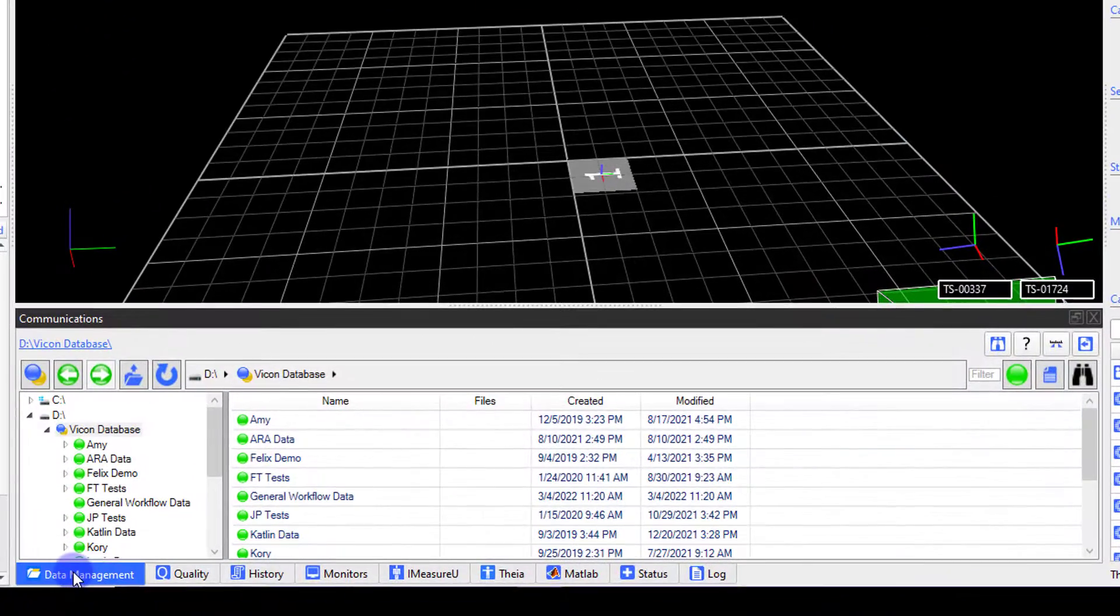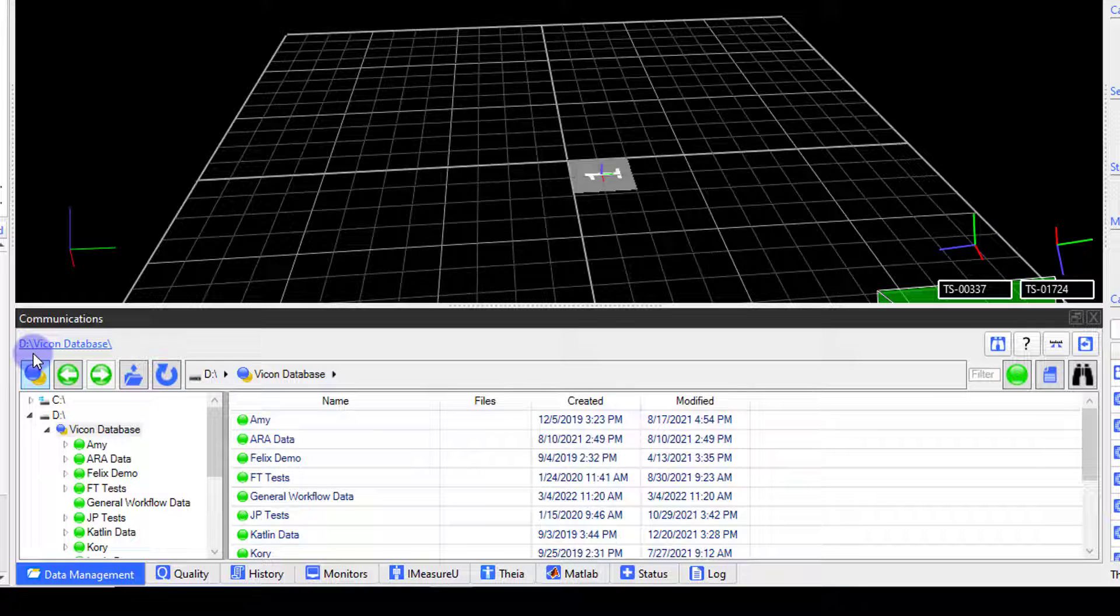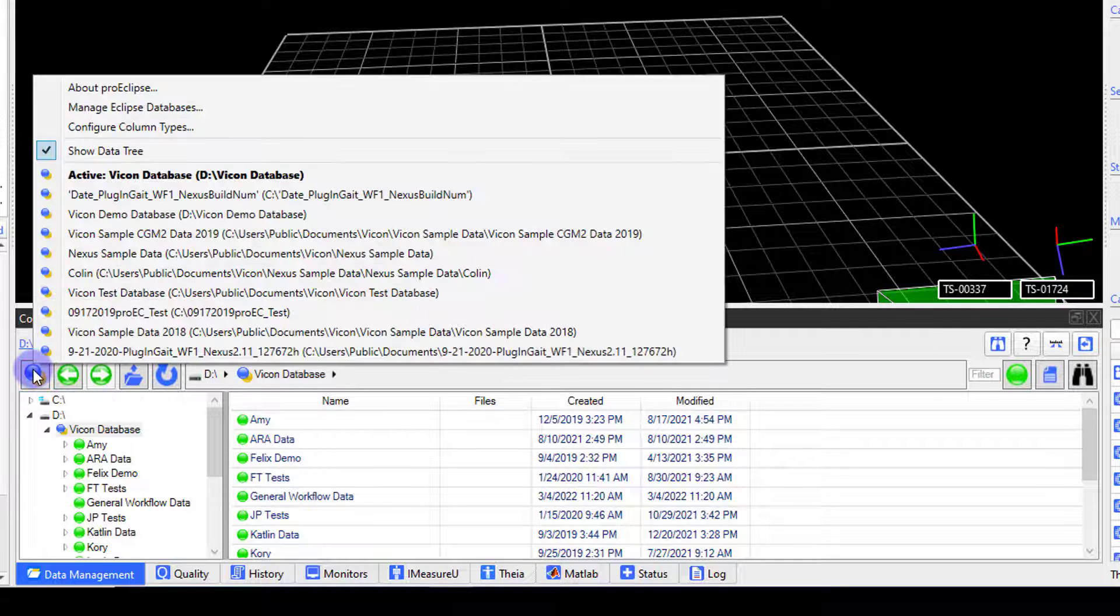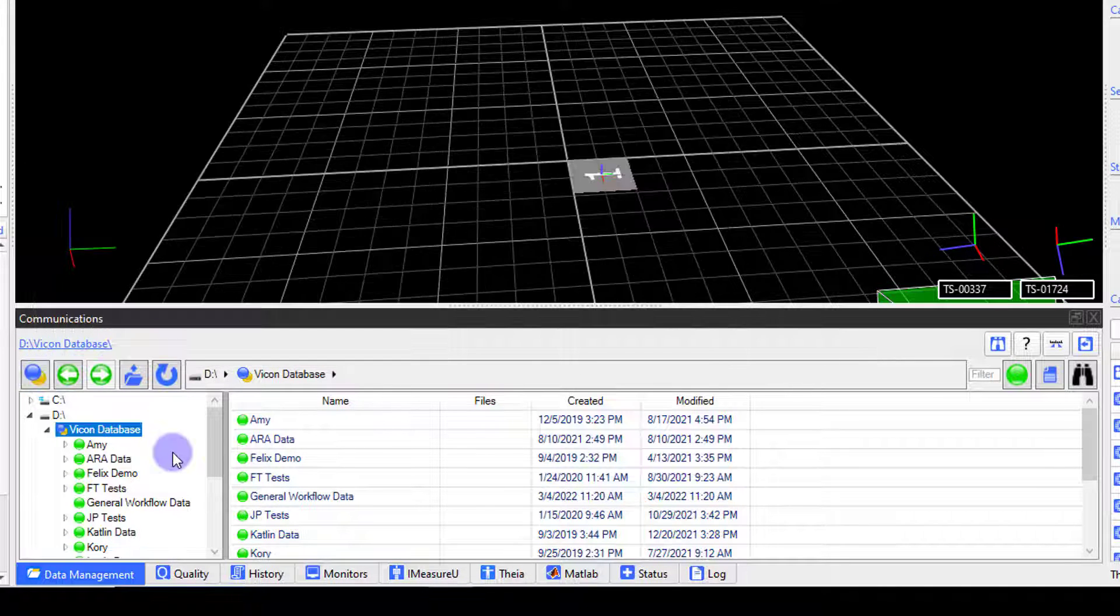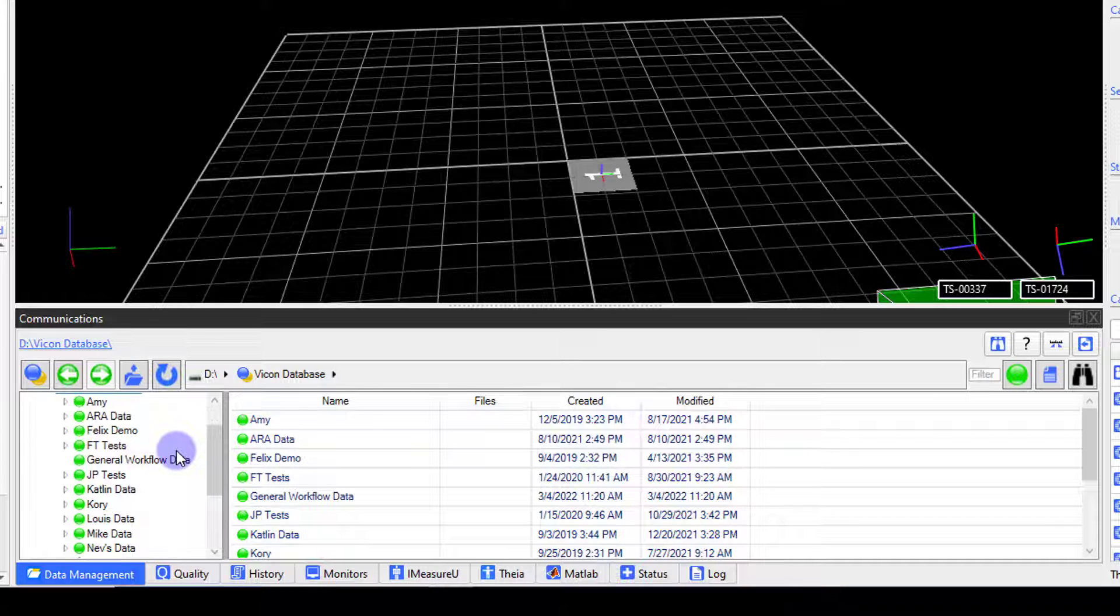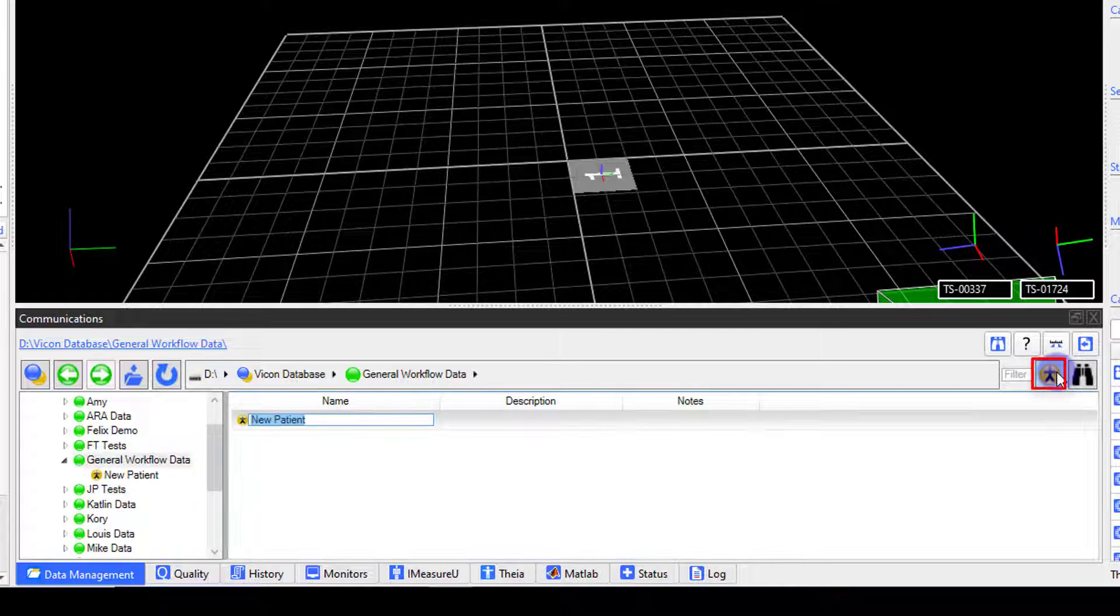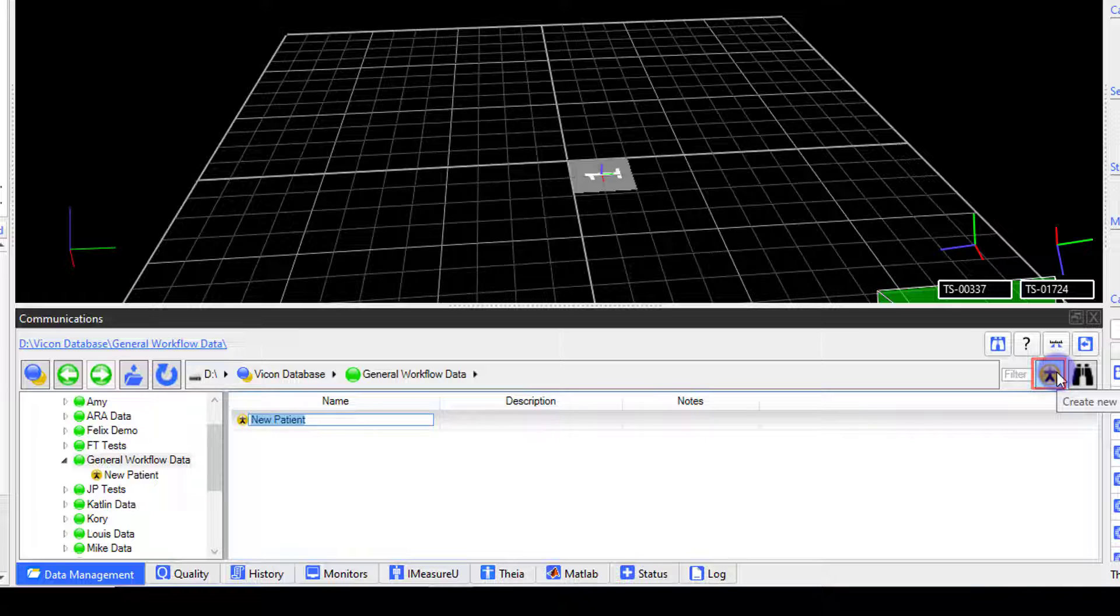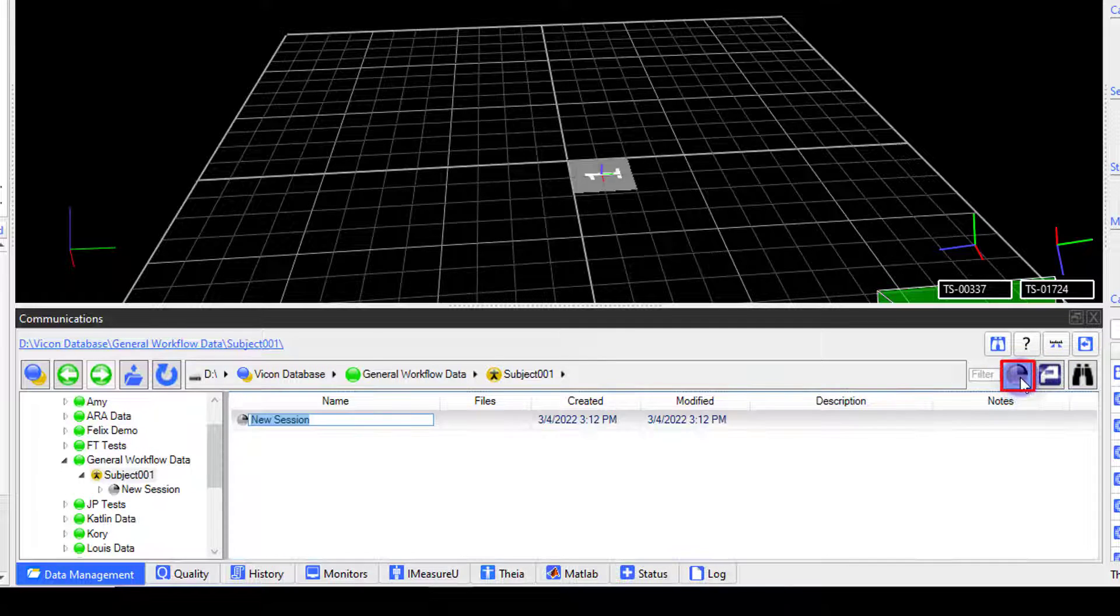The system is now ready to capture data, but first I need to set up the session folder into which the data will be saved. Using the Data Management tab, navigate to the correct database and patient classification. Then create your subject folder. And finally, the session folder.